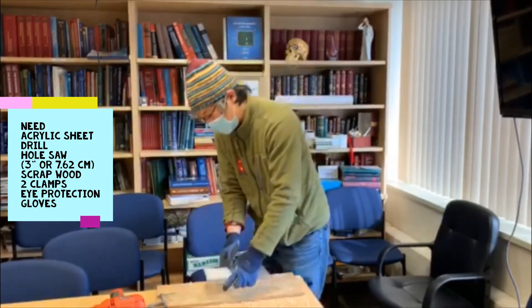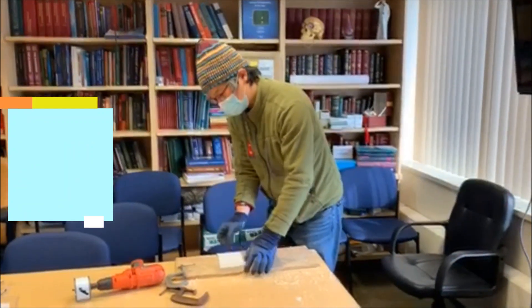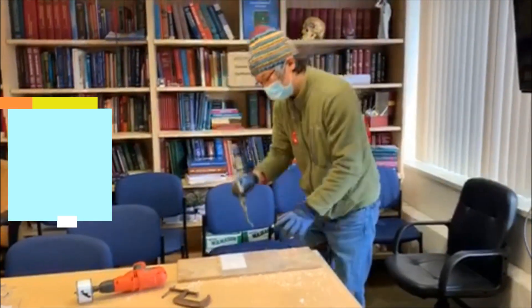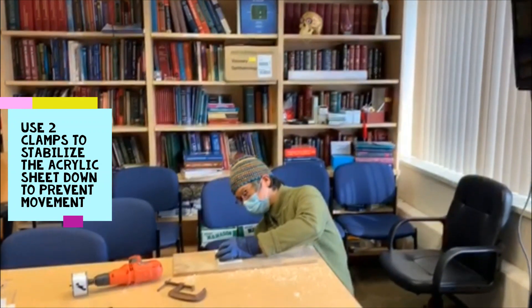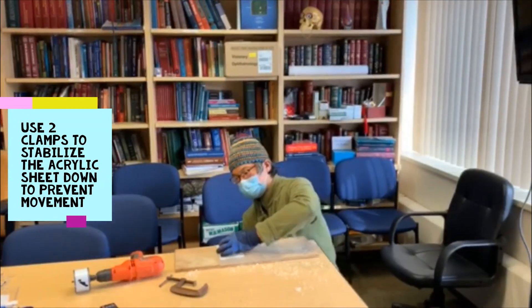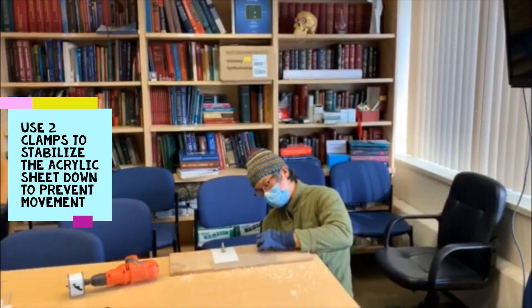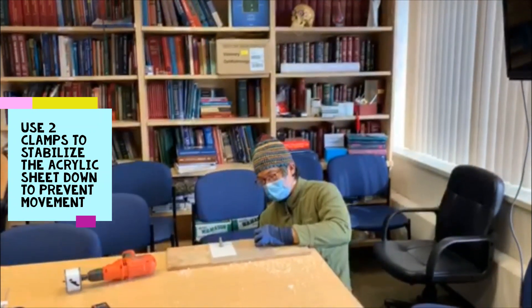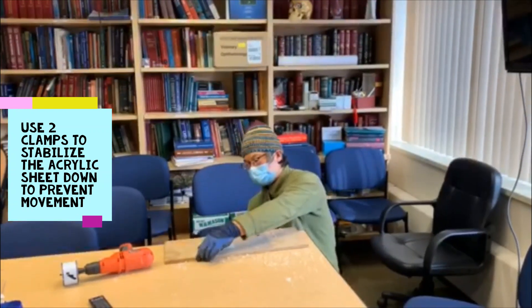First what we want to do is have a piece of wood underneath so it protects the table below. We definitely need two clamps here, so I'm going to clamp that to the table to stabilize. I clamp that nice and tight to the table here.